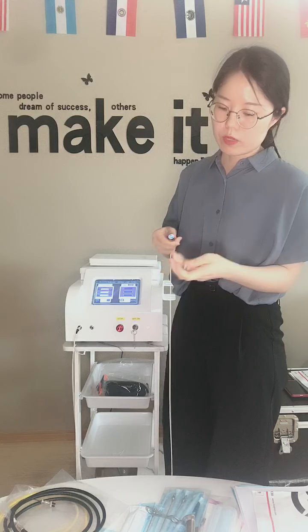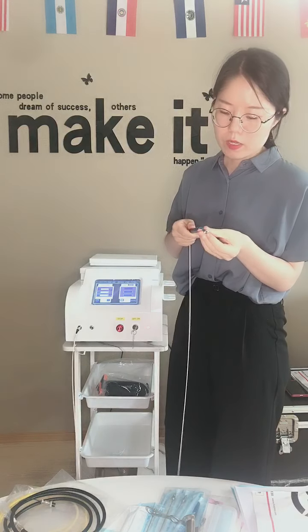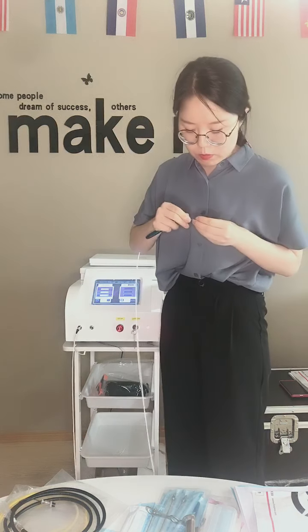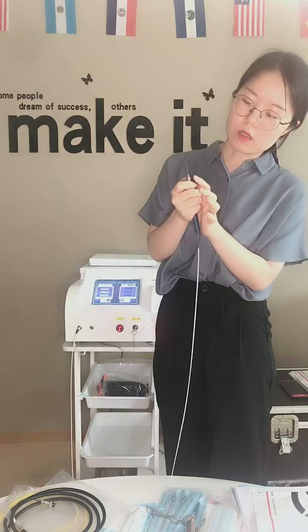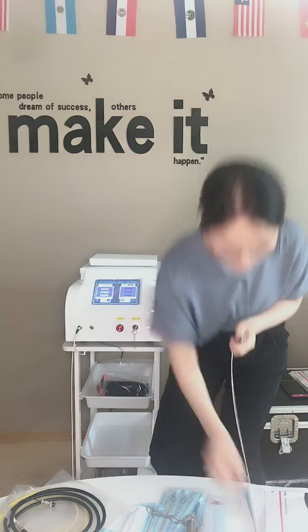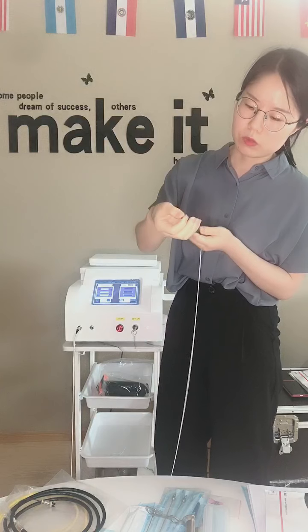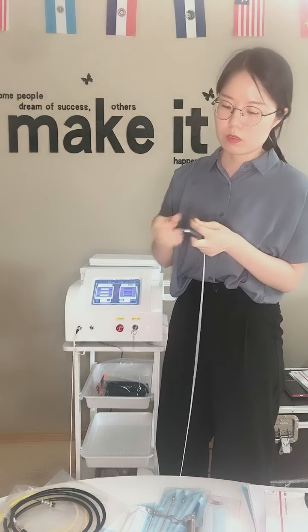Also the same way to install the fiber and the needle here. But this time it doesn't use the fiber needle, it uses the end needle. This is also the connector to install and fix the fiber inside. And here, this is the empty needle. Because we need to use the fiber, so we use the empty needle. Put it on. It's very convenient for us to make the treatment with it.